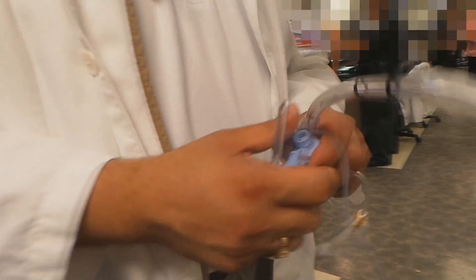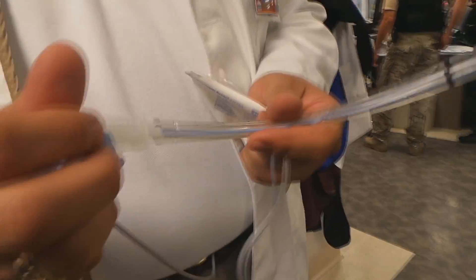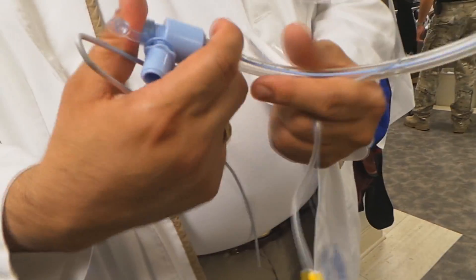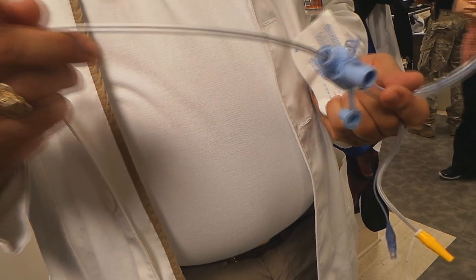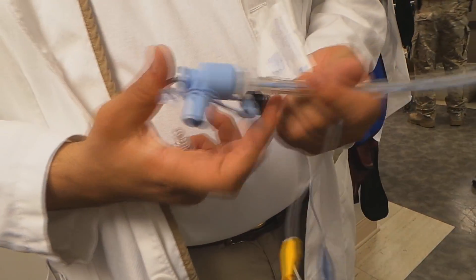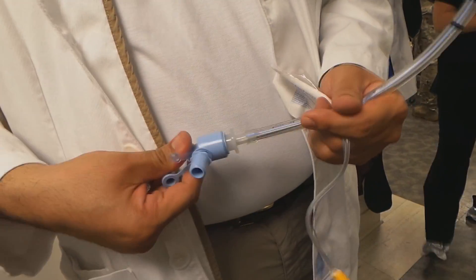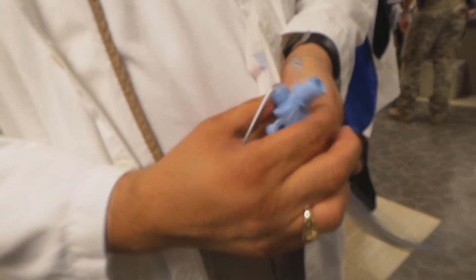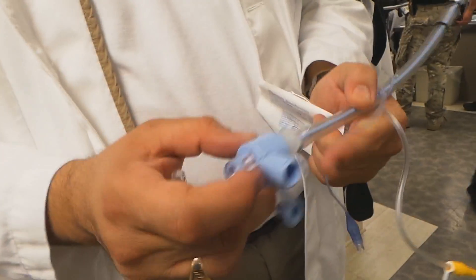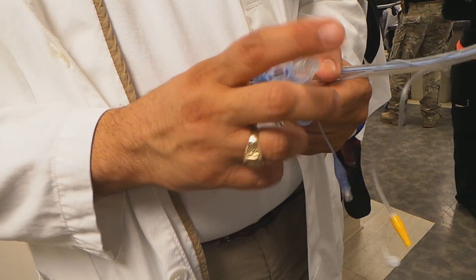Set up your ET tube just as you normally would, and put your swivel adapter onto the ET tube. You can put a stylet, or if you need to, pass a bougie through it. We're going to go ahead and put the stylet on — it goes right through the little hole that's meant for the fiber optic bronchoscope. Then you can hook up your meconium aspirator to the Y.